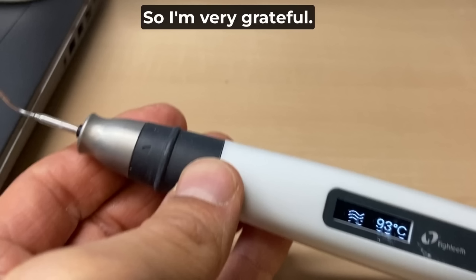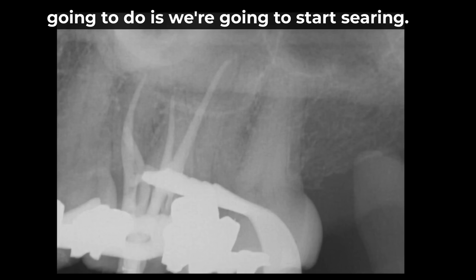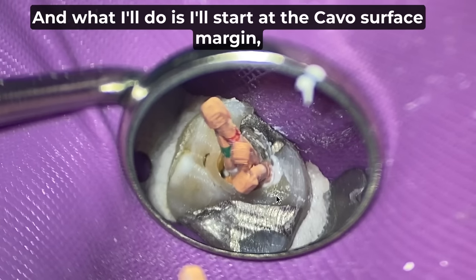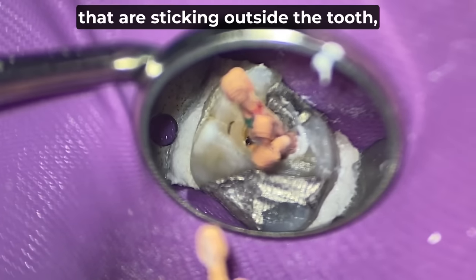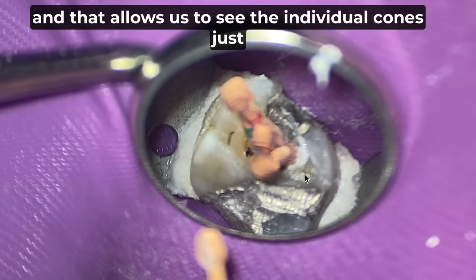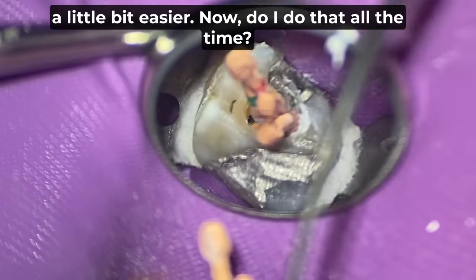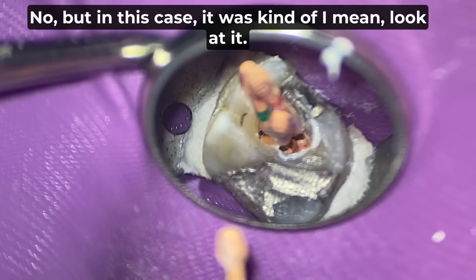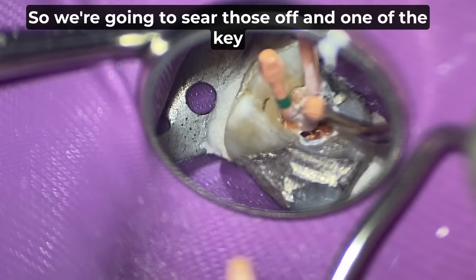We've taken our cone fit radiograph, and now we're going to start searing. I'll start at the cavosurface margin. I'll cut the cones off, just the excess sticking outside the tooth, and that allows us to see the individual cones a little bit easier. Do I do that all the time? No. But in this case, look at it. It looks like a bunch of spaghetti noodles. So we're going to sear those off.